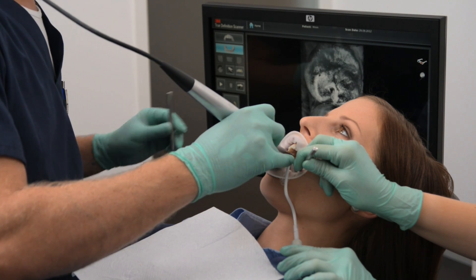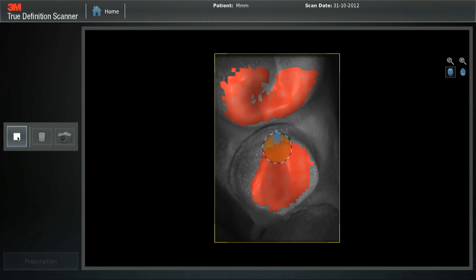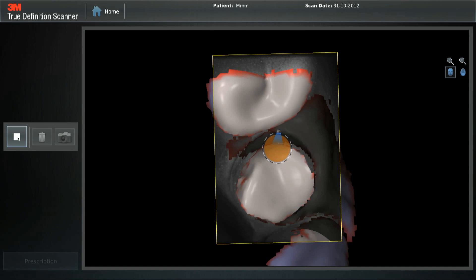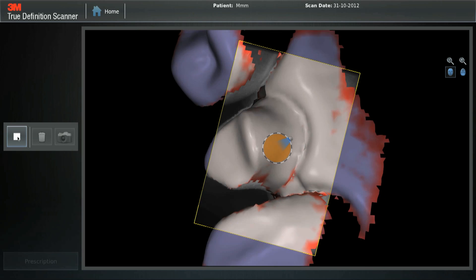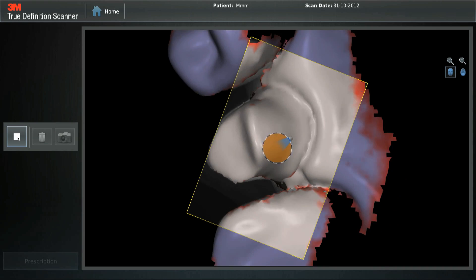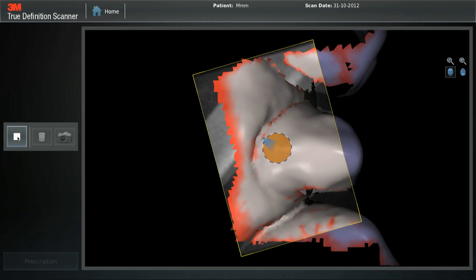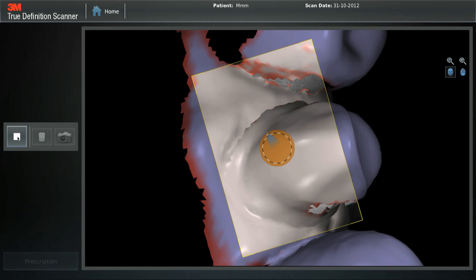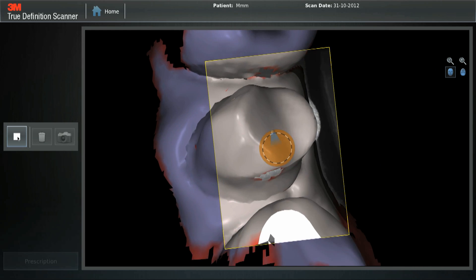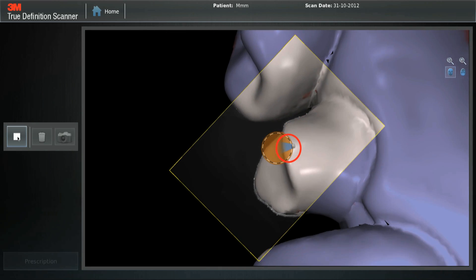Scan Preparation. The default wand orientation is the occlusal start position, which means the scan has to be started on the occlusal surface. It is best to scan the prep and contact surfaces first to avoid degradation of the marginal area. After capturing occlusal surfaces, rotate lingual, making sure to rotate a full 90 degrees. Rotate over to the buccal. To capture the interproximal surfaces, it is best to angle the yellow capture area diagonally to the surface you want to capture, as seen here.